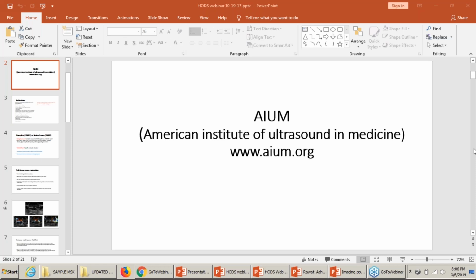Yes. So when do you do only NeuroMSK? So let's say you did an EMG and you have a patient. Yeah. So as an adjunct to EMG, or let's say you have some contraindication and the patient cannot have EMG, and you are only interested in their nerves, and you don't have any other reason to do joint ultrasound to look at the soft tissue structures, and you only want to look at the nerve, you will be doing NeuroMSK in that case. Okay. Thank you.